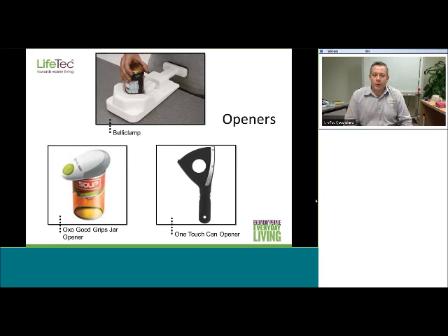Here is a cheap option for helping to stabilise aids and food preparation equipment on the bench. This is foam matting, which you can buy from $2 shops or from Bunnings by the metre. It's a very good multi-use aid. It's also useful for putting under chopping mats to stabilise them. You can also use it underneath plates and bowls while you're eating, to stabilise them.